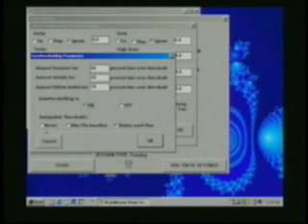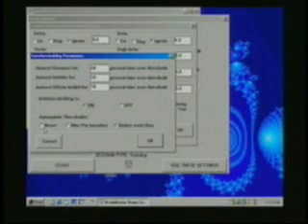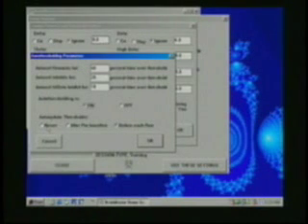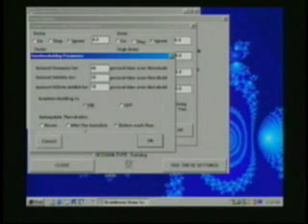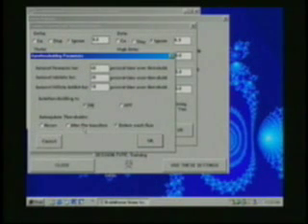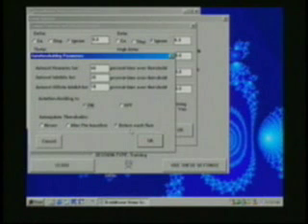You can either have it automatically update never, which means you'll only use manual updating, using the Y key on the keyboard. Or you can auto update after the pre-baseline, and we'll talk about what baselines are. Or you can auto update before each run.